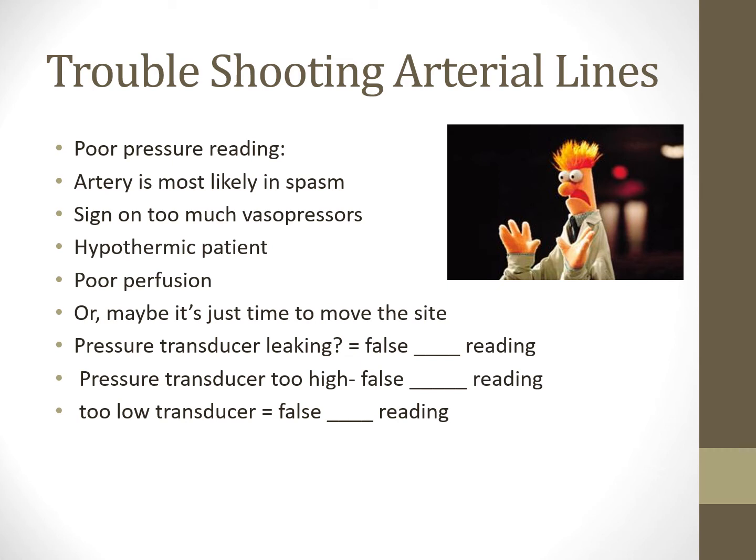So this is also where I reiterate why we check a manual pressure. When something looks off, hey, let's run a manual cuff. See what it is, compare the two. Does that verify what we're seeing?